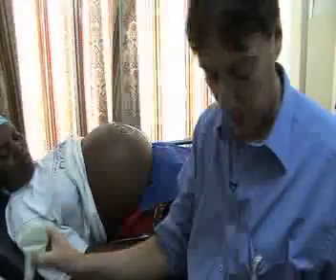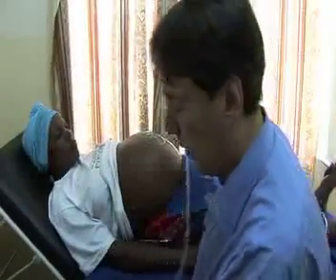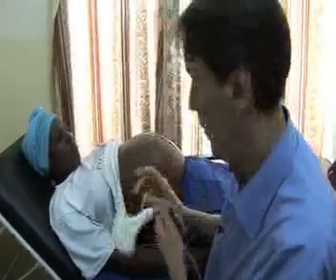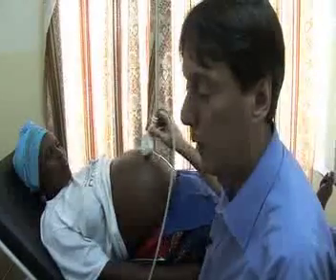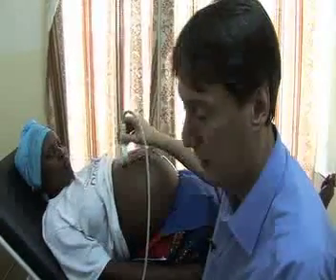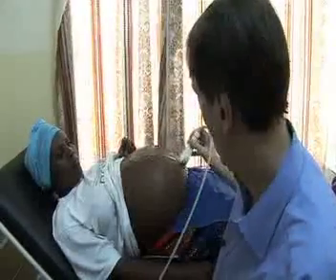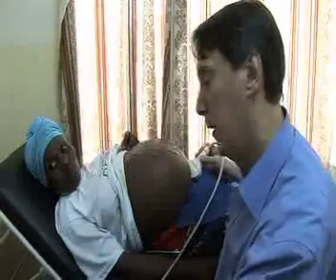I'm ready to do the scan. The young lady who was here doing the scan before I arrived has been called to see a patient on the labor ward, so she's going to come back in five minutes. She's asked me to start the scan because we're very much behind — there are about 40 patients waiting outside.